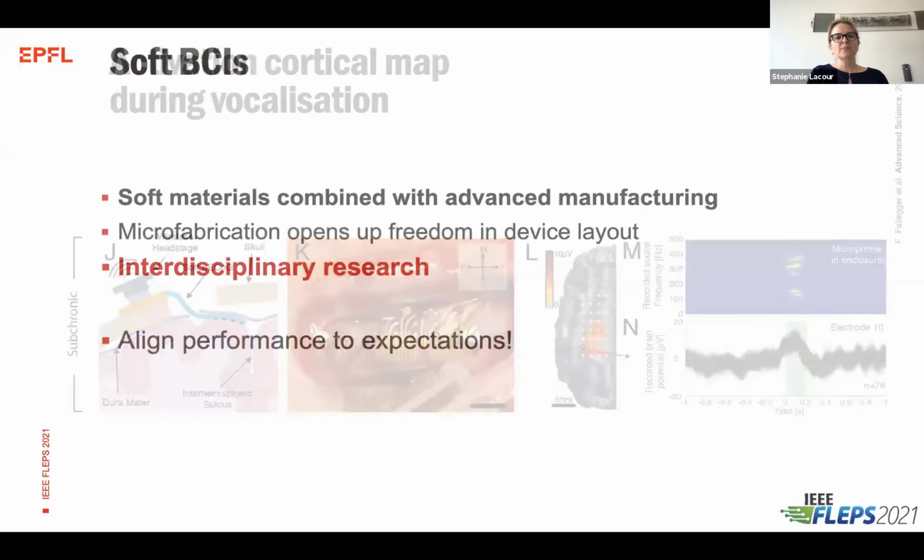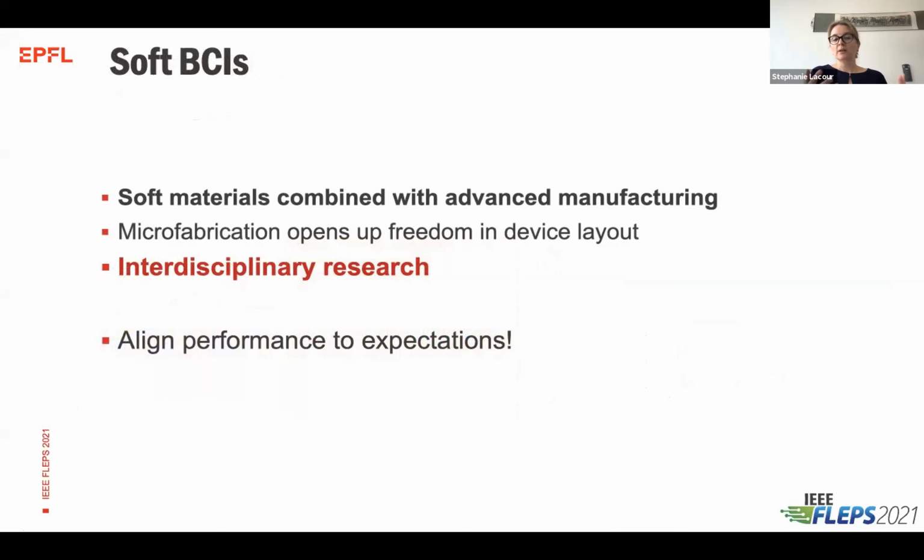And so with this, I hope I've convinced you that with soft materials, you can actually design and tailor the layout of the electrode to the zone of interest for the cortical interfaces. But you can also use, of course, the compliance of the system to design it to reach areas of the cortex that are not usually easily reached or explored with standard or stiffer technology.